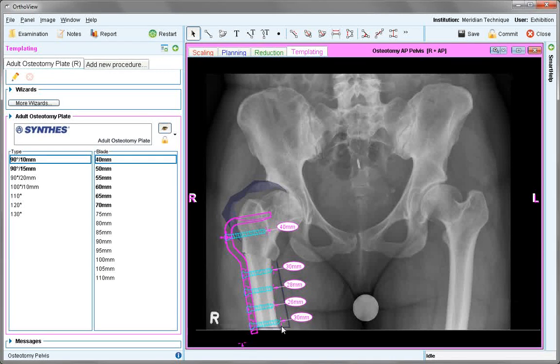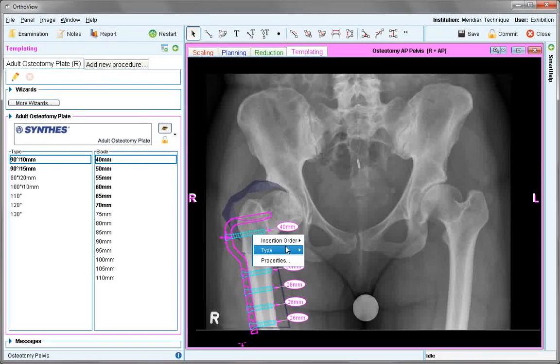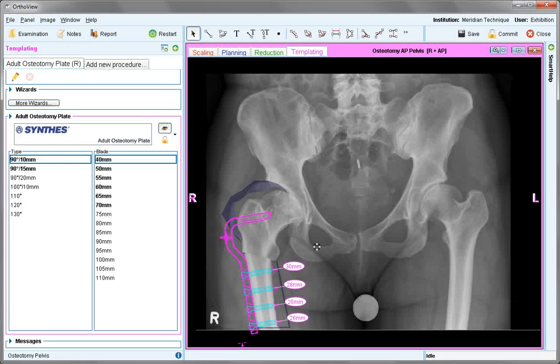Any screws that aren't required can be removed — for example, right-click, choose type, no screw.